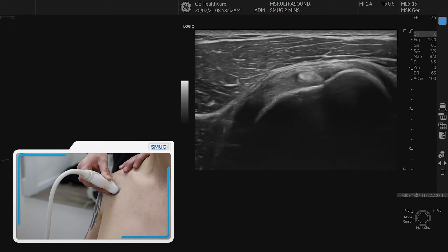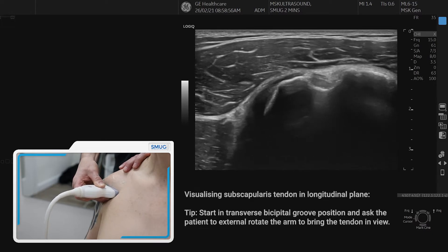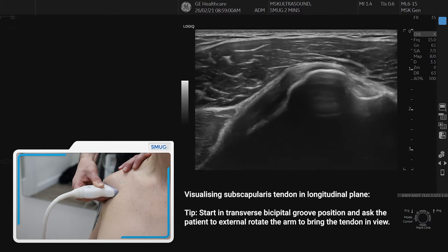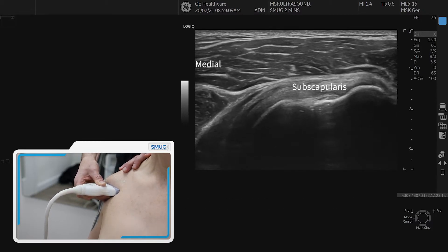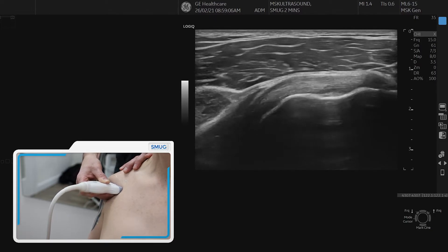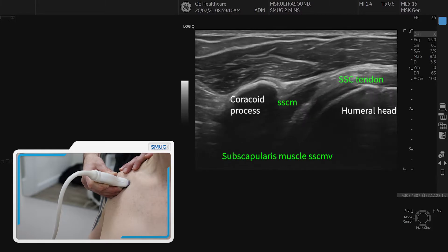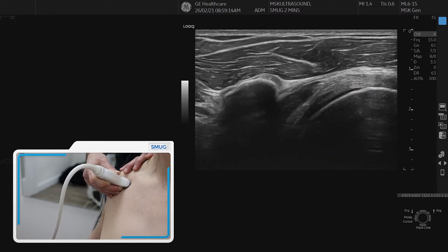Then we go back slowly, reverse it back to the bicipital groove and now we're going to look at the subscapularis. To do that, we ask the patient to externally rotate the arm slowly so the subscapularis comes into view with the longitudinal fibers of the tendon. Then you can move the probe medially and you identify the coracoid process as your landmark and you can also see the musculotendinous junction of the subscapularis.